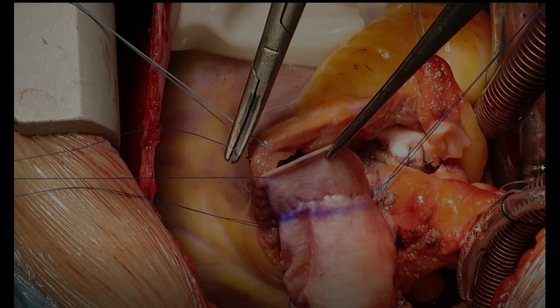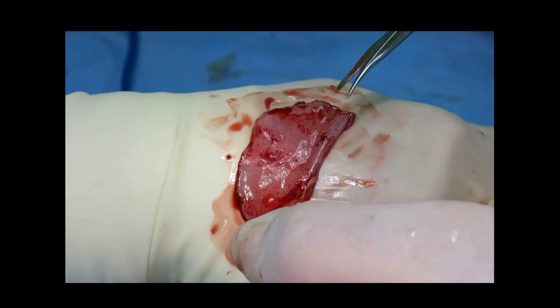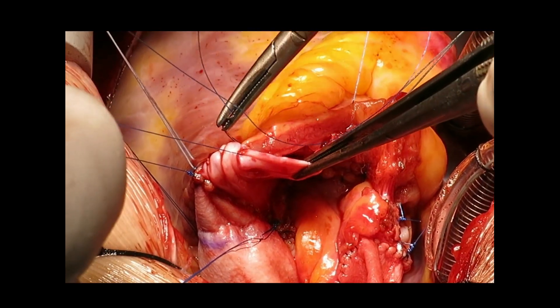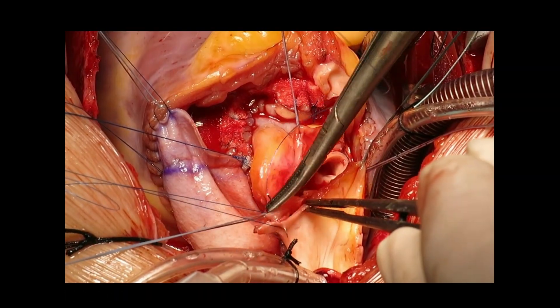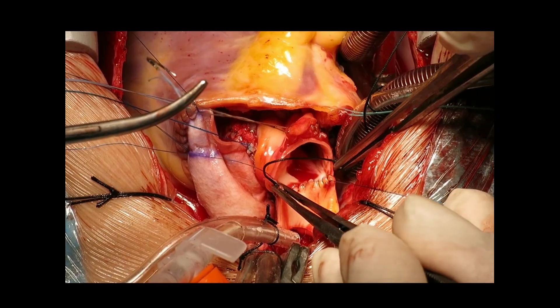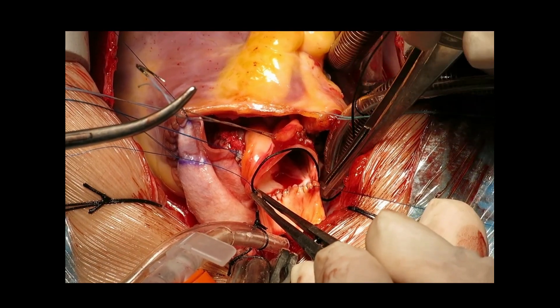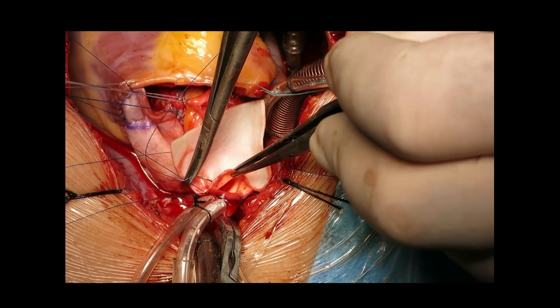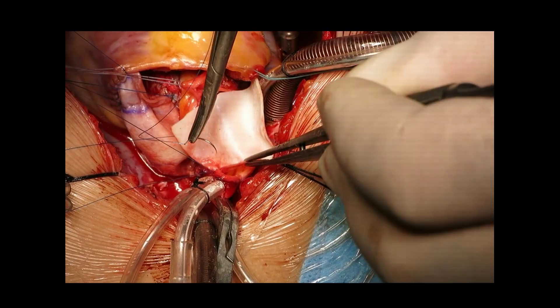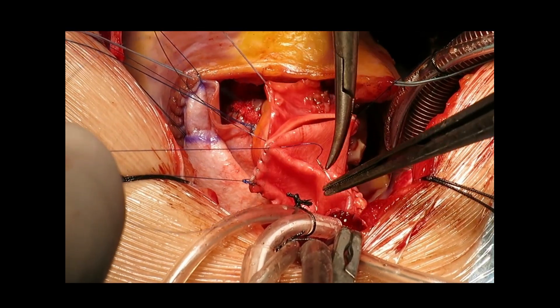The remaining part of the bovine patch is sutured to the ventriculotomy incision, but closure here requires additional pericardium due to Konno enlargement. For aortic reconstruction, we anastomose the autograft to the remaining posterior aortic wall of the ascending aorta, and complete the anterior closure with a properly sized quadrangular bovine pericardium. Please note that both the PA and aorta now have native tissue posterior walls and bovine patch anterior walls, which provide growth potential for both in the future.